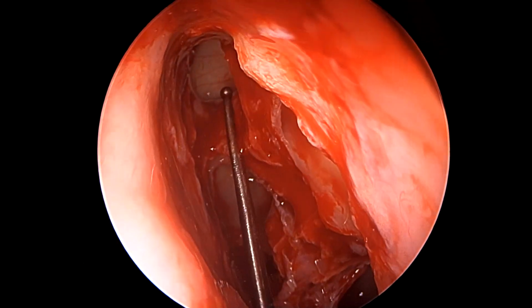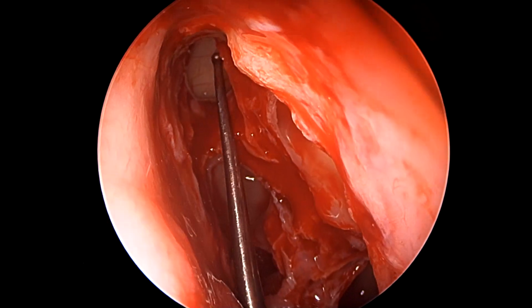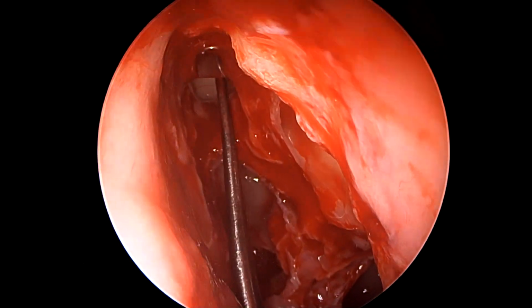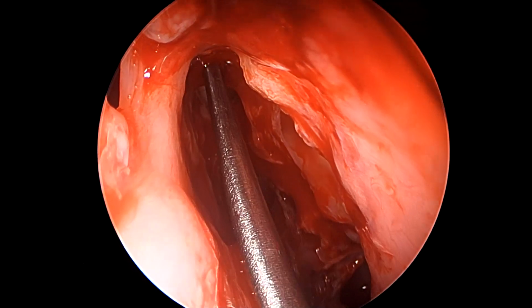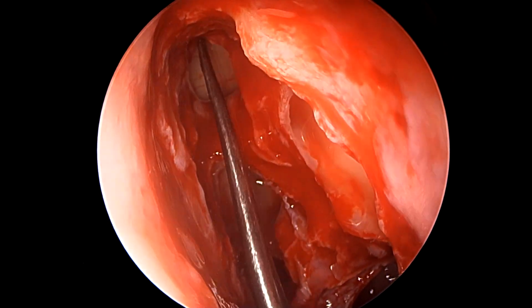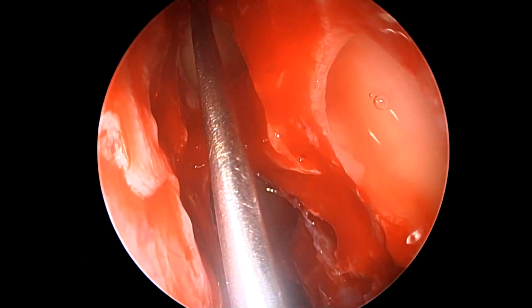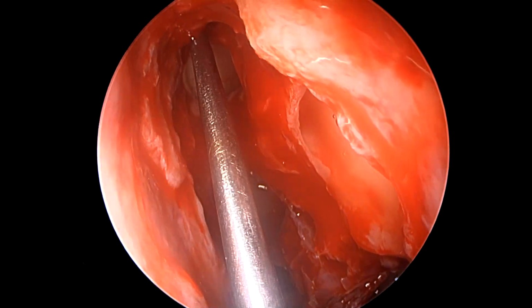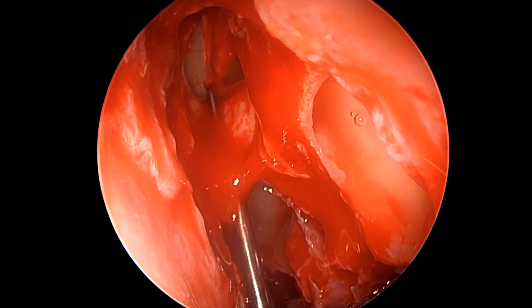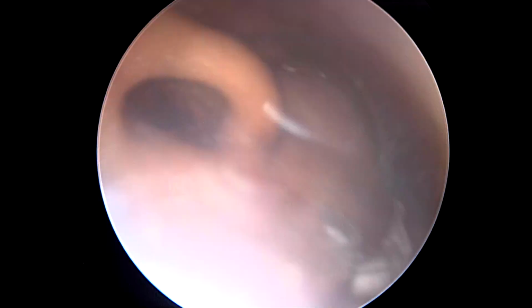And now once that has been done using the curette as well as the giraffe forceps, what we see here is a gross opening, a large opening inside the frontal sinus on the left side, where the anterior wall of the suprabullar cell has been mostly removed, and thus we can enter the frontal sinus clearly, and this sinus is now amenable to irrigation with saline, with steroids, and to relieve the patient's symptoms, which happen because of a very tight constricted frontal recess and frontal sinus opening.